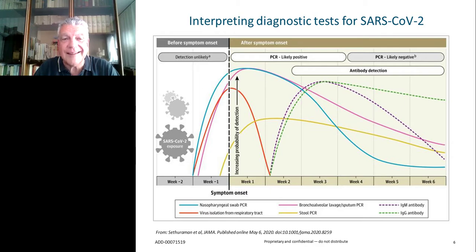Of course, this is a scheme and does not pretend to be exhaustive on all possibilities that you will encounter in clinical practice. But testing for RNA yields different results according to the source of samples, as we have seen. Regardless of that, you may note that when you reach this point, around 3 weeks after infection, it is even less likely than before to attain a positive result.